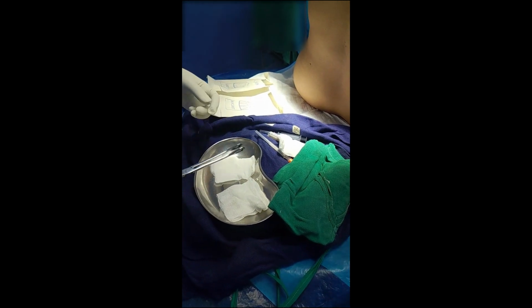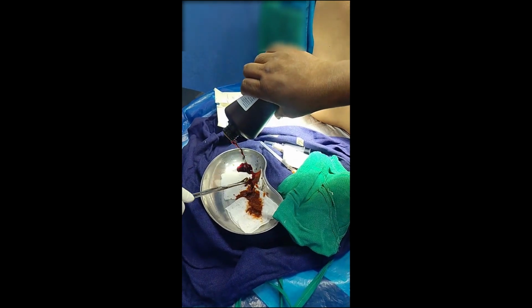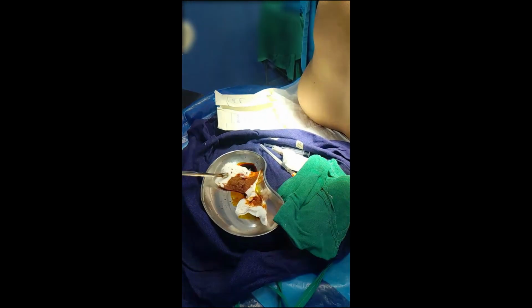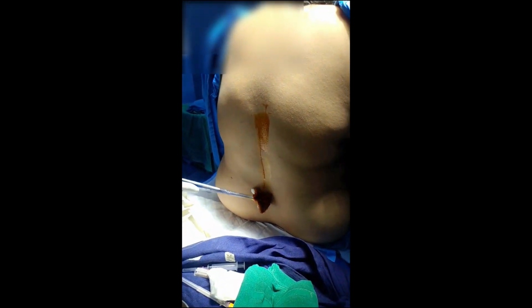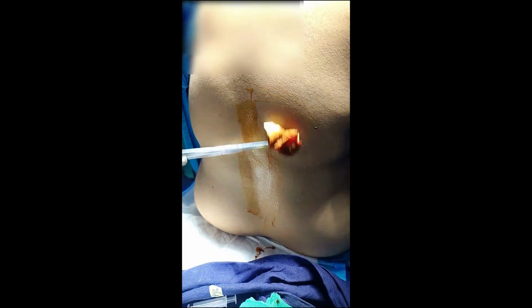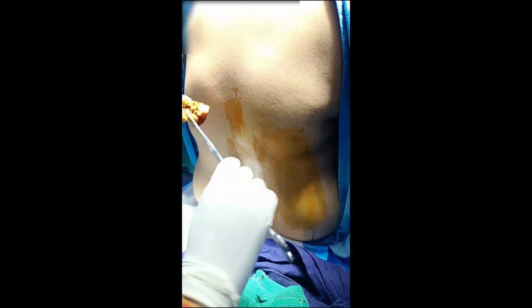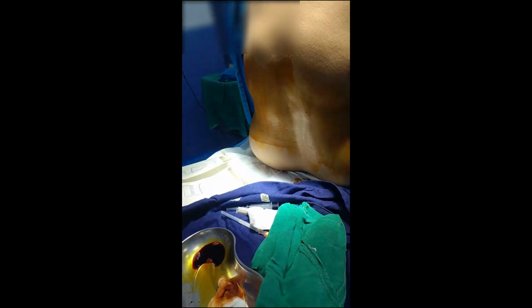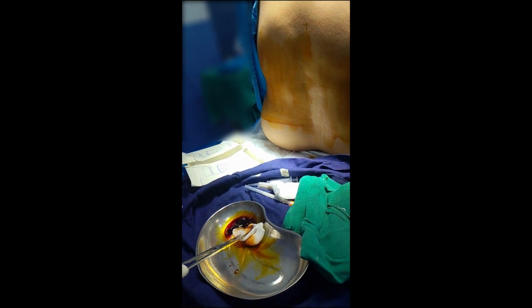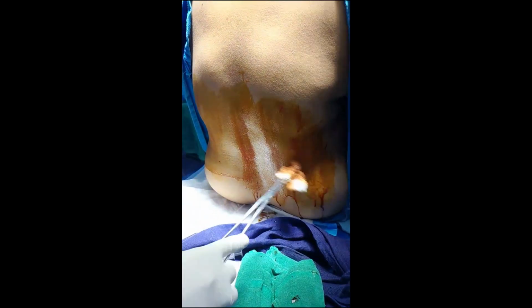Ask someone to put betadine solution for cleaning the skin. I'm using a 10% betadine solution to clean the skin. Clean the skin properly. The cleaning should be inside to outside. Clean it twice at least.